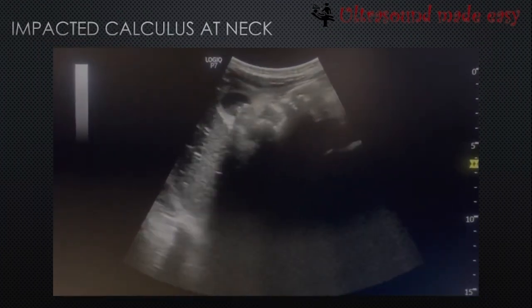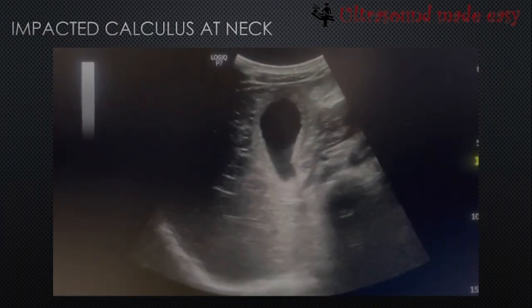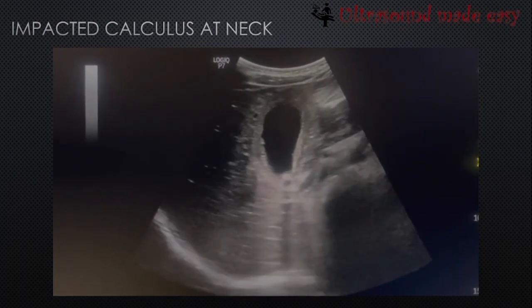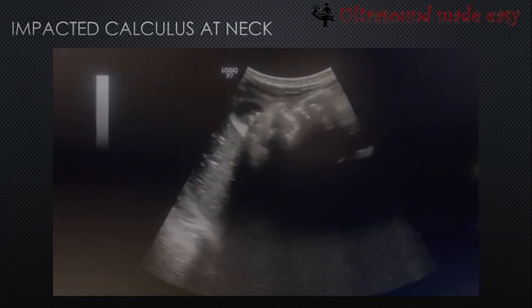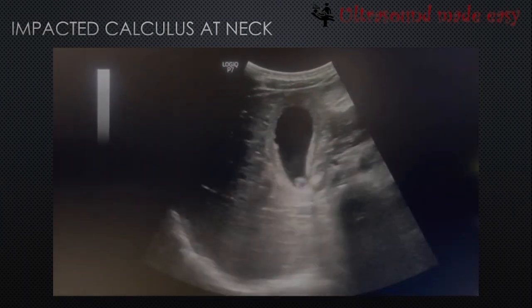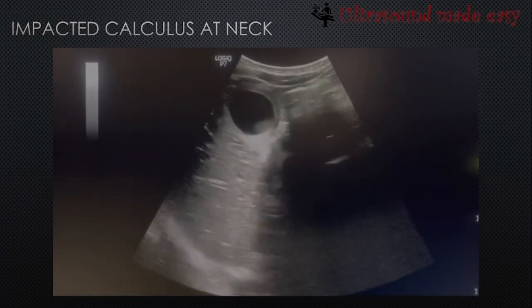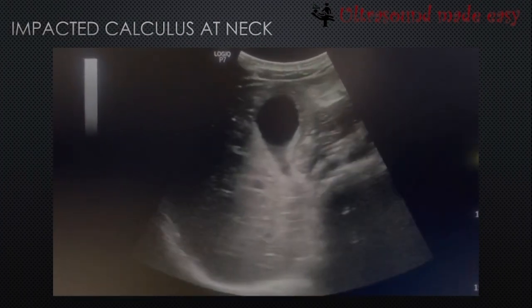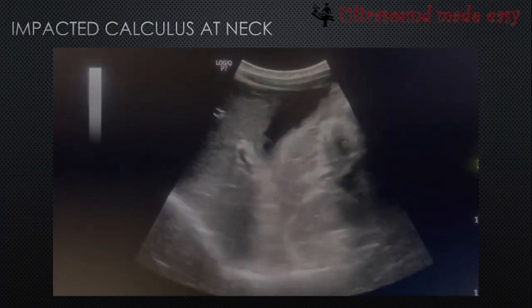This is another case. This is a distended gallbladder, and at the neck, it is clearly visible. Some small calculi are present at the fundus along with sludge in the distended gallbladder. This is the calculus. Small calculi are present at the fundus, and there is a calculus present at the neck.